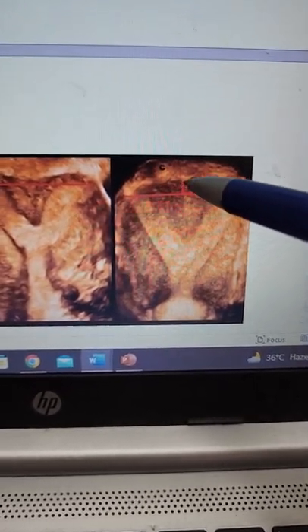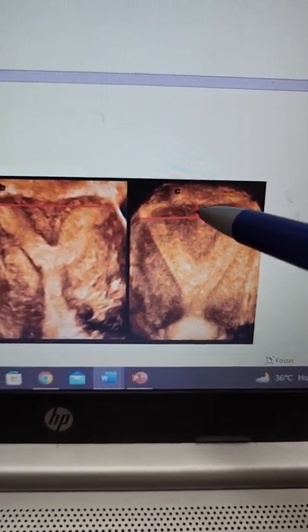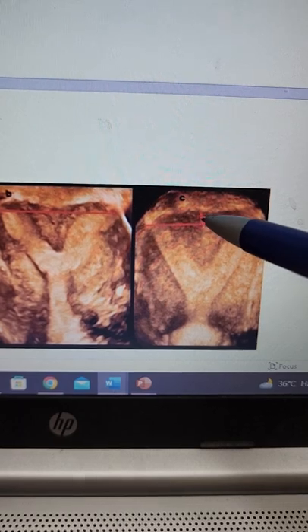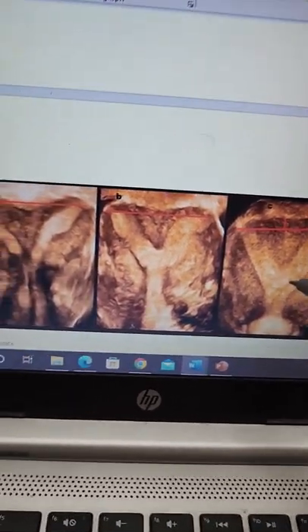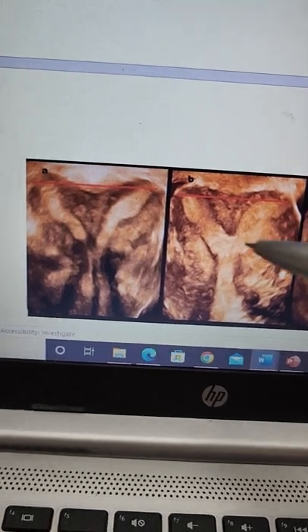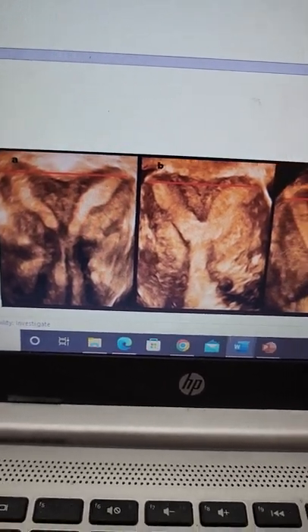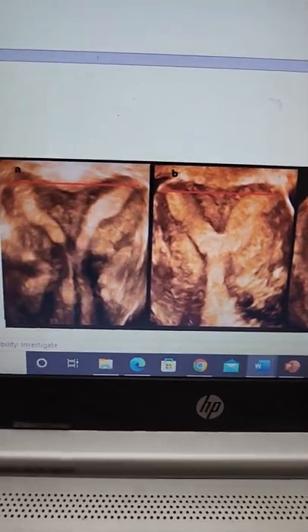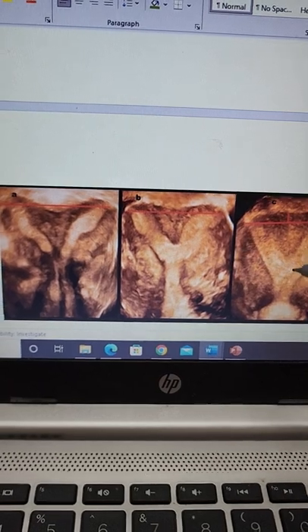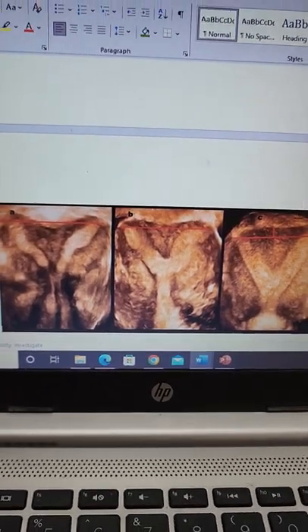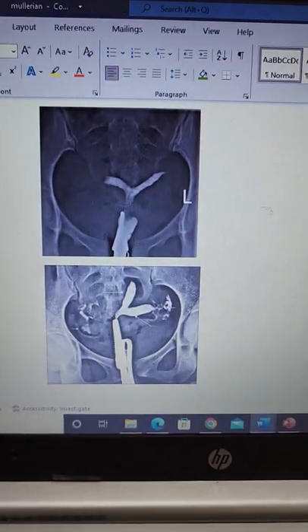However, if the distance between the uterine horns and the fundus is more than 5 millimeters, it is a septate uterus. This is the best non-invasive way to differentiate between a bicornuate and a septate uterus on a 3D scan — and as mentioned earlier, on an HSG, the accuracy is limited.